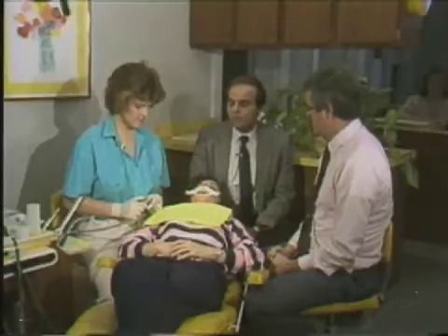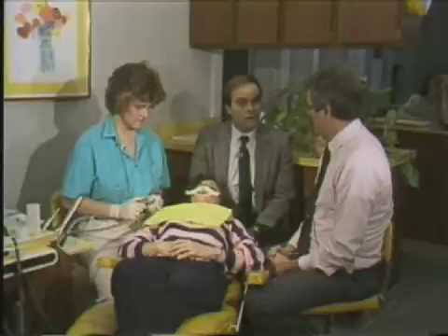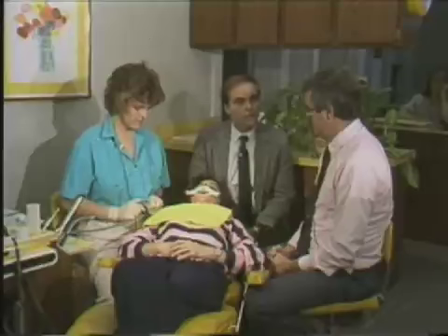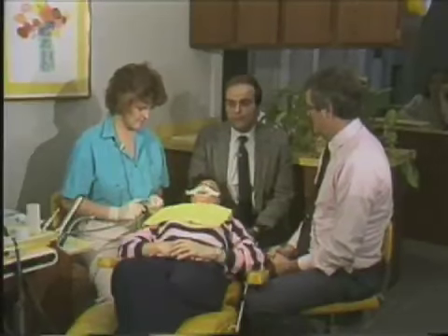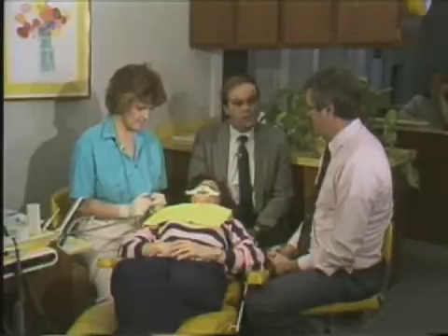Now, this thorough rinsing is critical for two reasons. One, it removes the demineralized particles that we've loosened with the phosphoric acid. And second of all, it removes the calcium phosphate salts that were created from the phosphoric acid. And it's critical to have this thorough rinsing to get these particles off the enamel surface to give us a clean area to bond to.